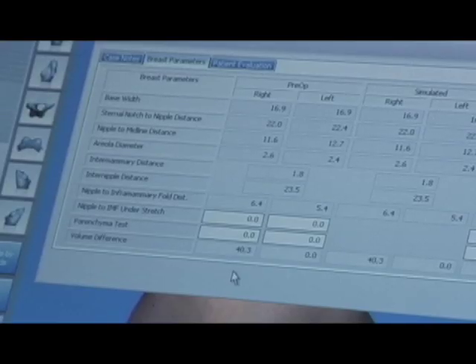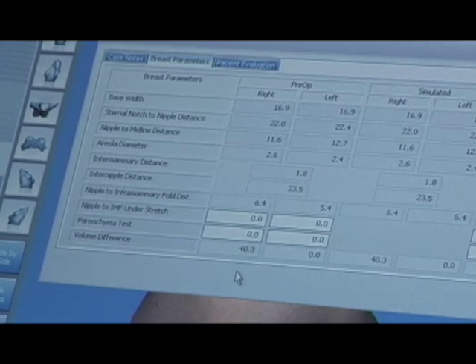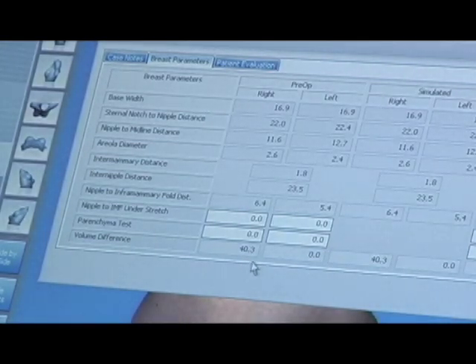One of the advantages of building a three-dimensional model of the breast is it lets us take some very accurate measurements of the breast. Here you can see the computer has determined the base width of the breast, which is the width of the breast at its base. On both sides, it does a calculation and determines the width is 16.9 centimeters. We can use that information when we're actually picking the implant.